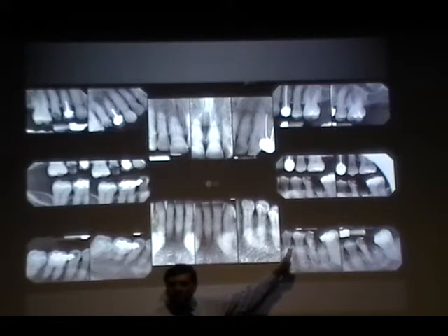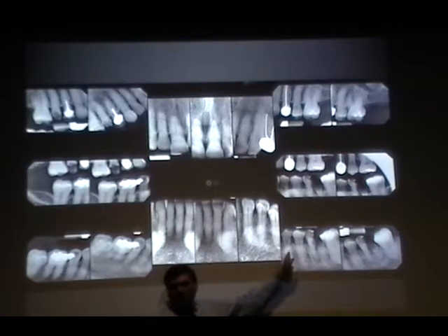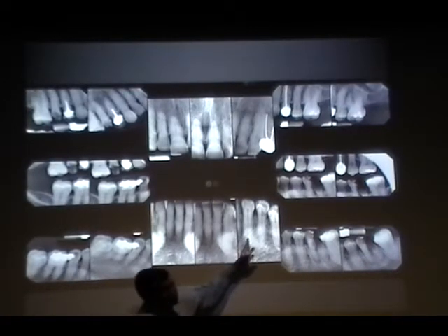My name is Shuchi. I think this picture looks fine. We can see the apex and also the contact. So what are the things that you want to see in this image? This left canine, do you see that? No, right? So it's important that you have to capture the distal canine. Okay. Moving on here. How about this one?